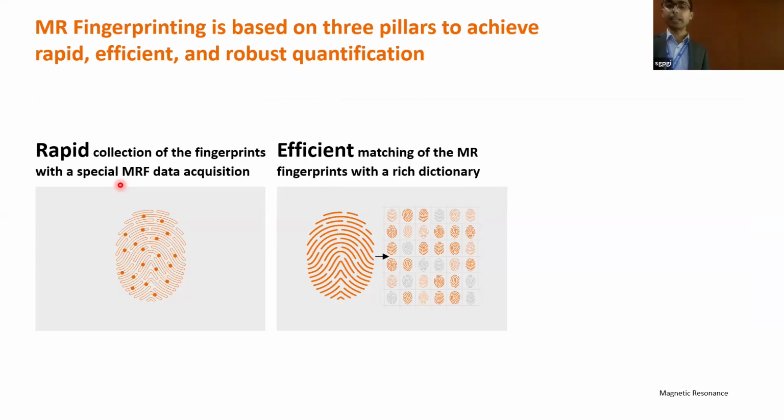So these are basically simulation-based calculations done by algorithms, where you know the spin patterns, and the algorithm basically defines thousands of possible combinations of your relaxometry data. That is your T2 and T1 relaxation part.